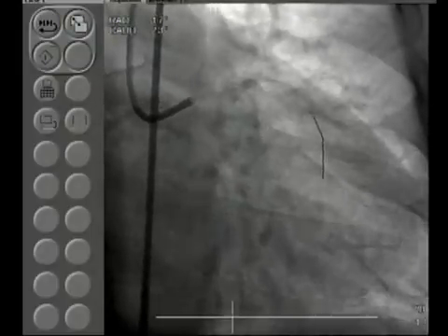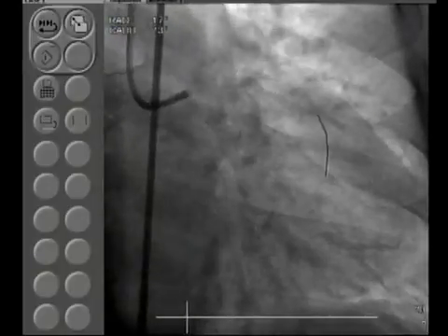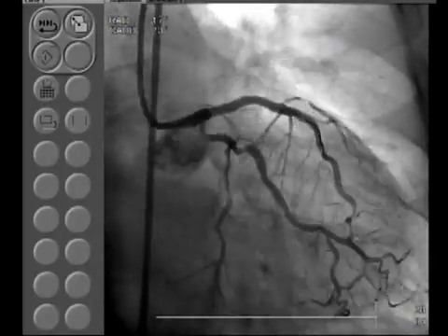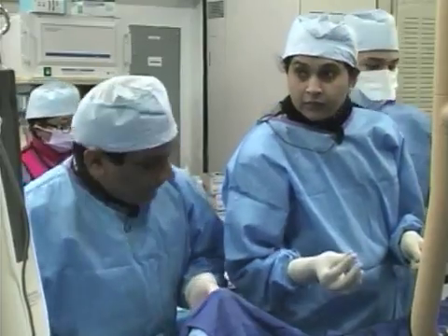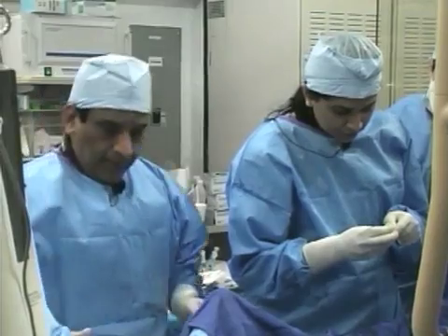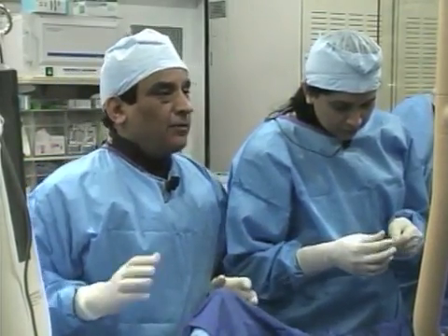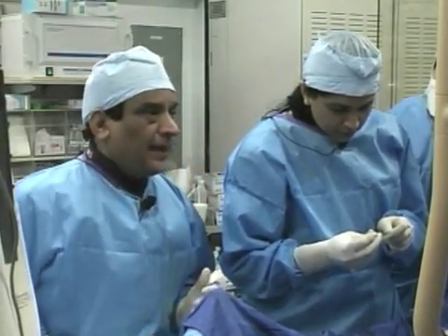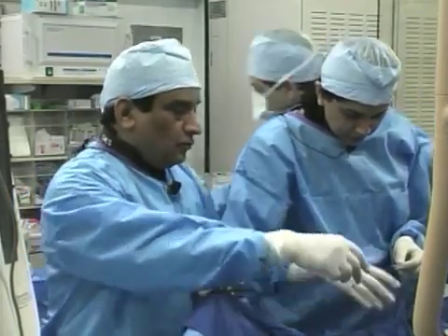the vessel wall. Now the question came up: can we do the OCT, or is OCT better than IVUS? I can tell you I have no authority on it, but I can just show both techniques. We have done the IVUS at baseline, and now we are going to show the OCT in this case post. And if you ask me where the OCT will pan out compared to the IVUS, one of the big issues has been the cost point of view, and where we are going to use it.